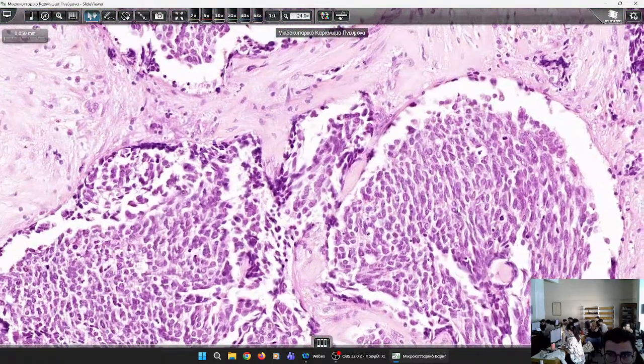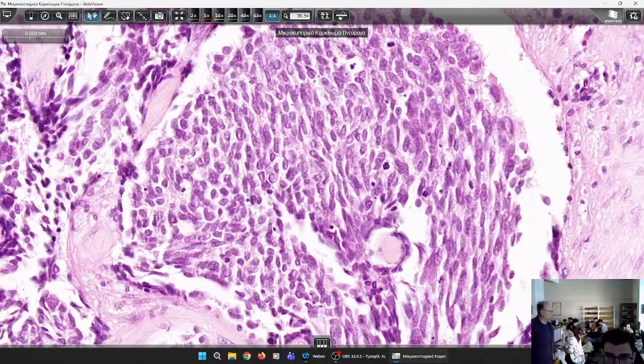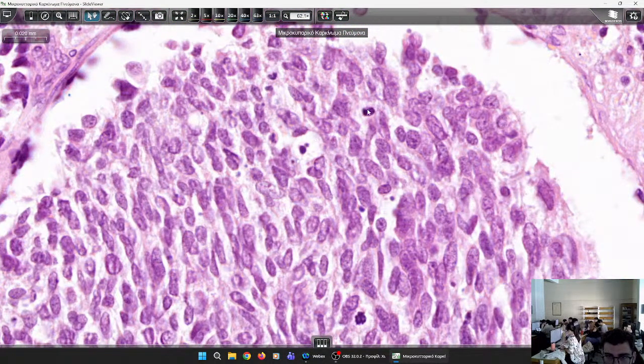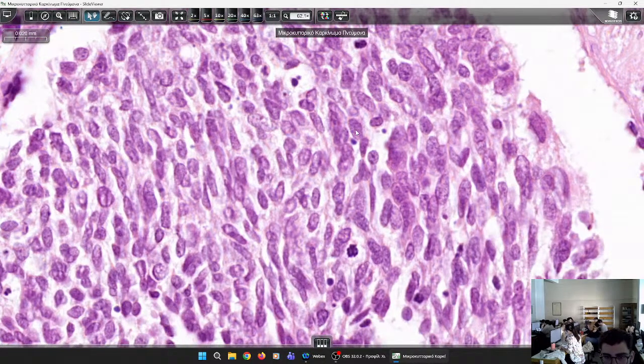So, the increased cellular proliferation rate and the increased apoptotic index of small cell carcinoma malignant cells are related to their chemosensitivity. So you give chemotherapy and the tumor responds first, but at some time it is no longer responsive to the chemotherapeutic drug, and that's unfortunately the cause of death of the patients.